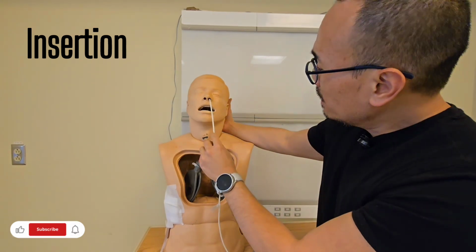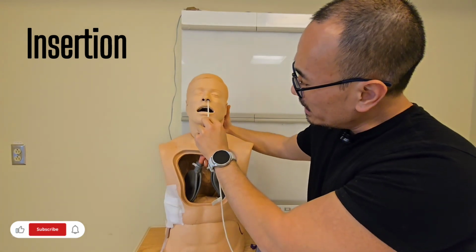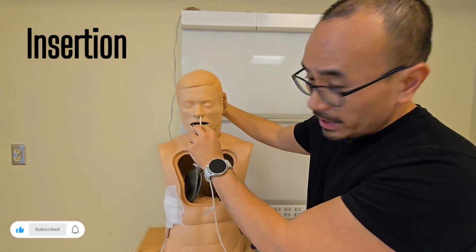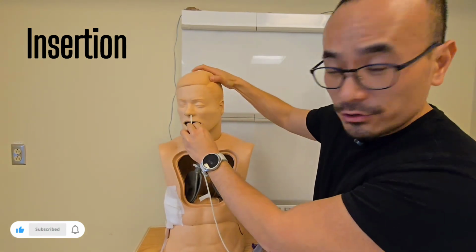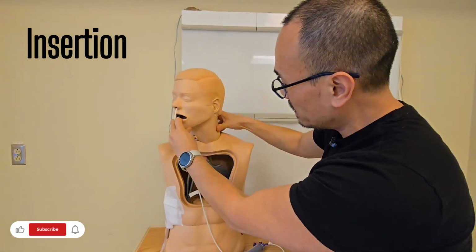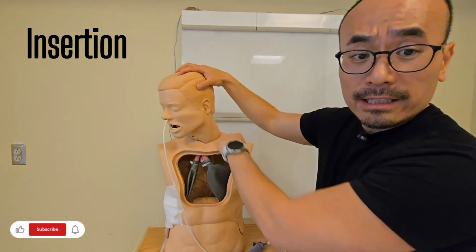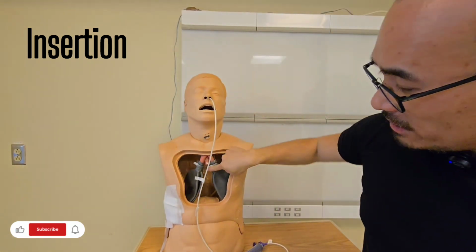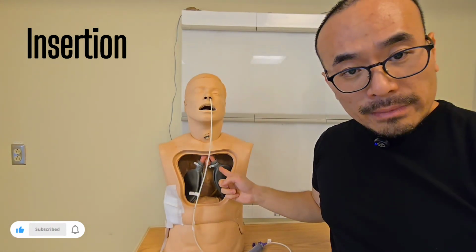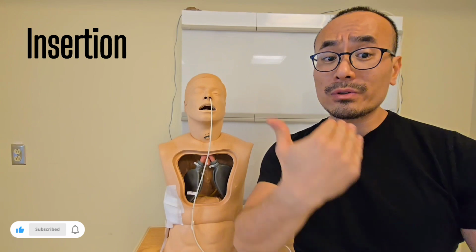Okay, so when the tube starts to go in like this, the patient, Mr. Smith, you're going to tilt your head forward. As the patient tilts the head forward, it actually creates a curvature at the back, as you can see over here. I'm going to just move the mannequin's head a little bit. It creates a little curvature, and this curvature will guide the tube into the stomach. Why is that important? Because as you can see from here, anatomically speaking, the lungs are anterior and the esophagus is posterior.